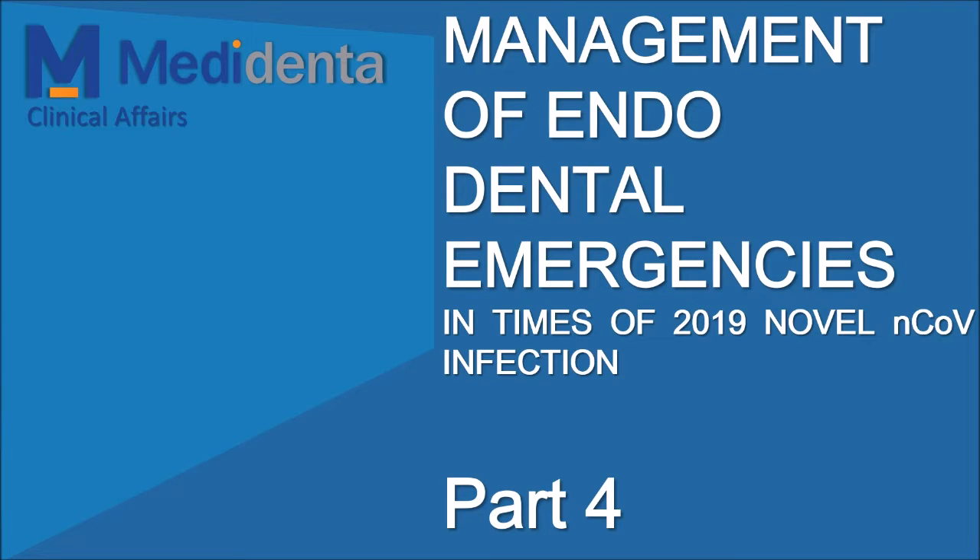Hi, I am Carlos Spiranelli-Ramos and in this segment I keep showing some PPE options and a high-speed handpiece option for less spray formation.